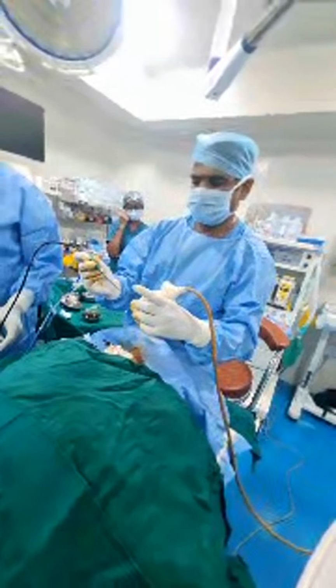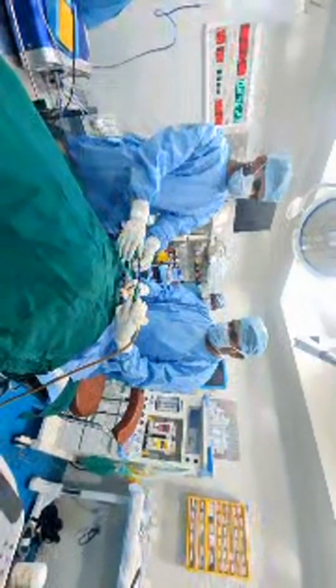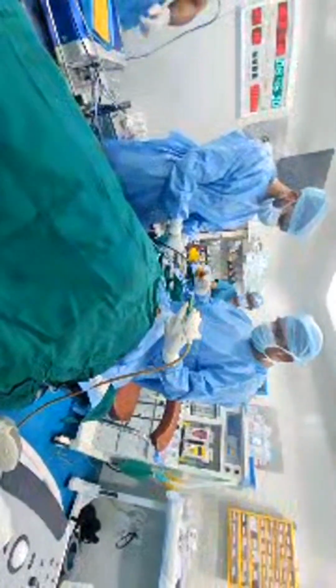Everything is under guidance. So this needle will go into the thyroid under ultrasound guidance. I'll show you how it appears when the microwave starts working. Usually bubbles will be appreciated.